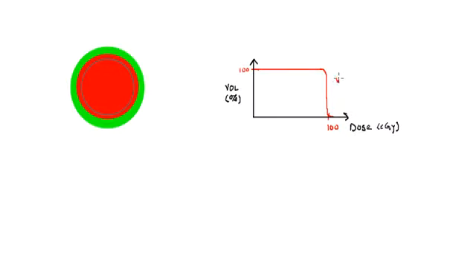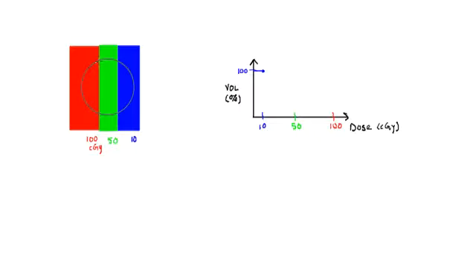Okay, now one thing is that so far what I've been talking about is something that would apply to a uniform dose like this, like we talked about before. But in practice, a lot of times we have a non-uniform dose, like maybe the tumor isn't completely covered by one single dose. So how do we deal with that?